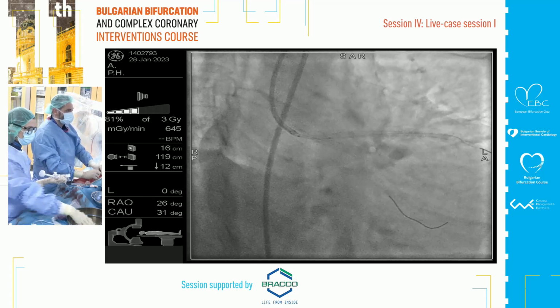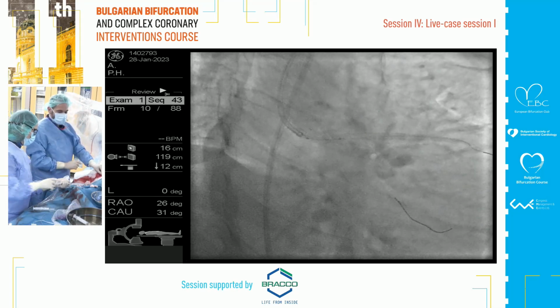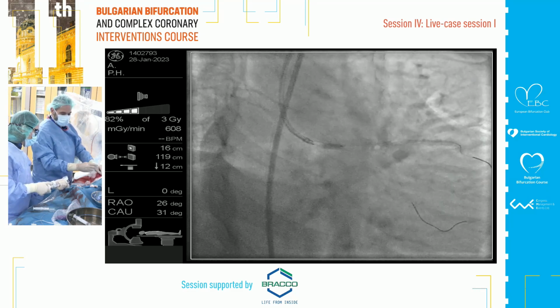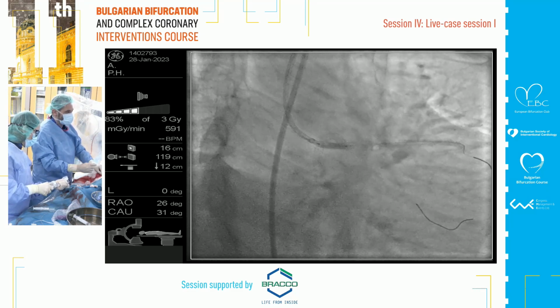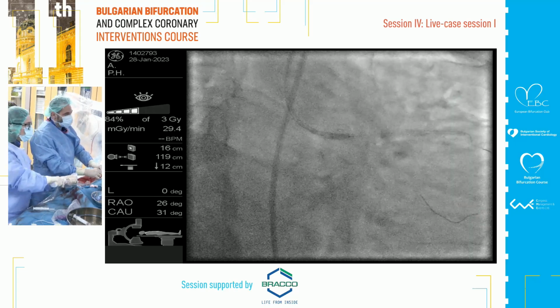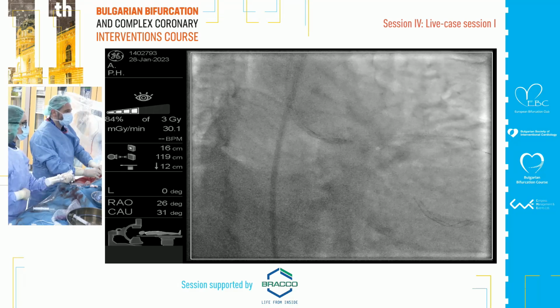Difficult, huh? Okay. The wire is across the balloon, so it is twisted. 11, 18. There's only one. Twisted, but maybe one after 2 hours is not a problem.